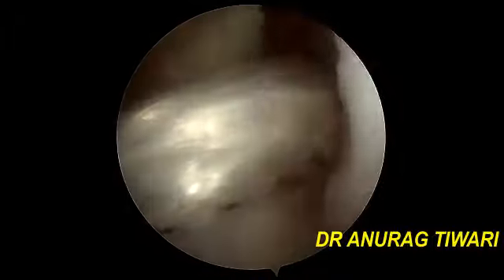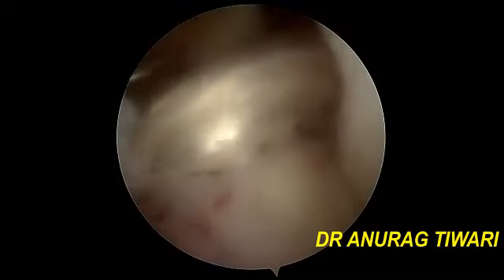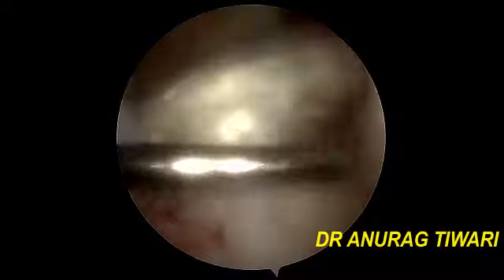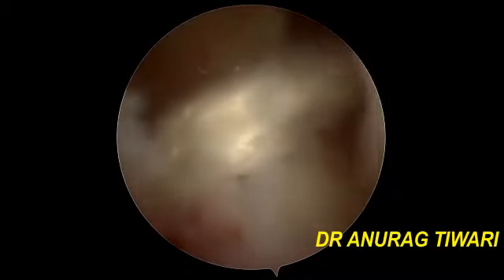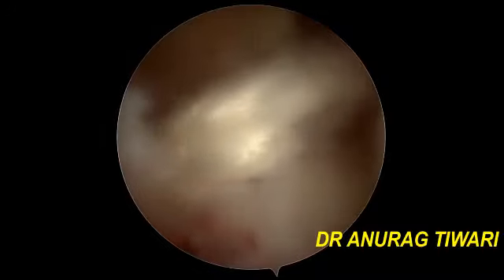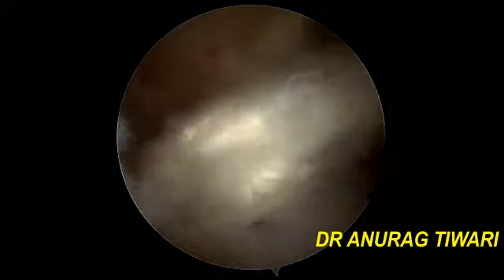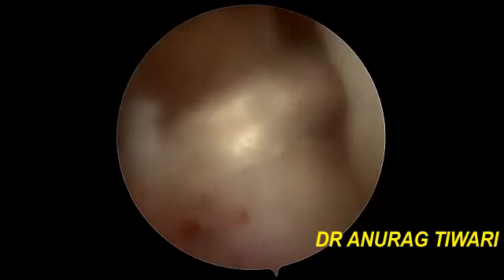So this is after the final fixation. You can see a very well fixed graft from the femur onto the tibia, and using the probe I can see there is a great tension in the graft. This looks good. There is no impingement, there is no blowout, and the knee looks good.